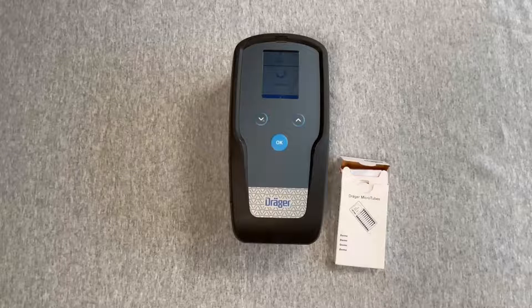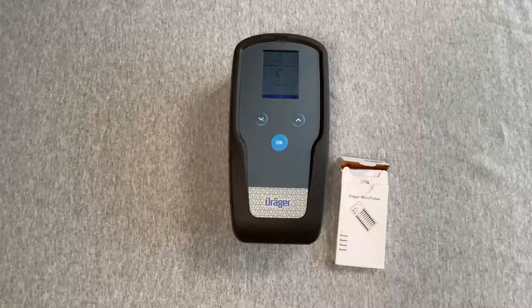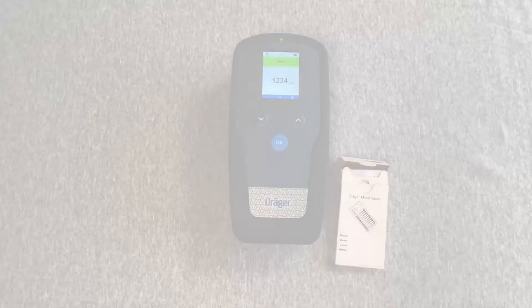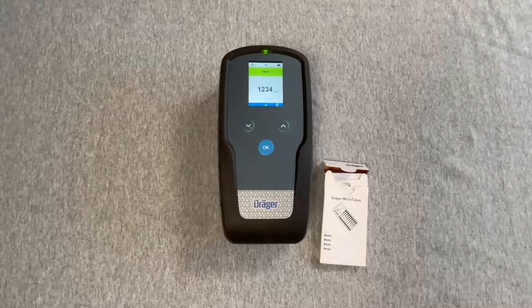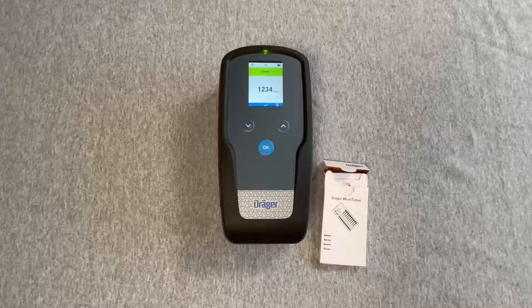The measurement time is defined by the individual microtube and the actual concentration present. The demo microtube runs for less than 30 seconds. The display will indicate 'Measuring' until the measurement is complete. At the conclusion, the LED turns green, the gray bar behind the chemical name becomes green, and the concentration is shown in the display.